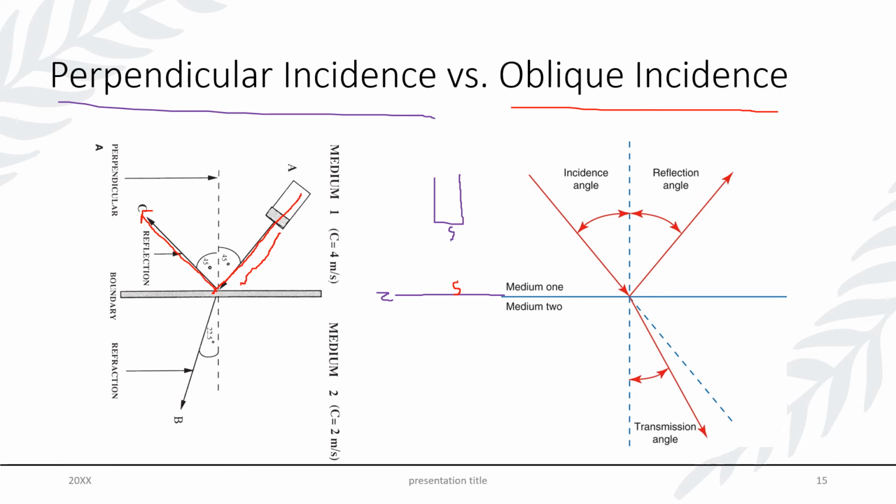Now, that which was transmitted, part of the transmission coefficient, is not going to continue in the exact same trajectory through the media. If the new media, media 2, has a slower propagation speed than medium 1, the angle of transmission will be decreased.